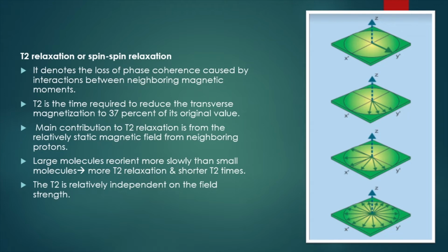The fat comes faster towards the z-axis, whereas water stays more towards the xy plane. So that's why fat gives a high value on T1. Because Z is represented by T1, isn't it? No, it's not like that. Basically, every tissue in the body has got a T1 and T2 value. So based on their T1 and T2 values, you get the signal.